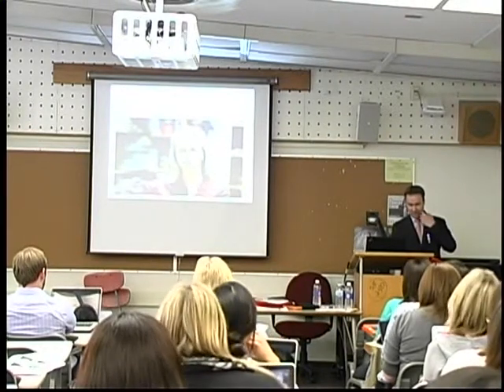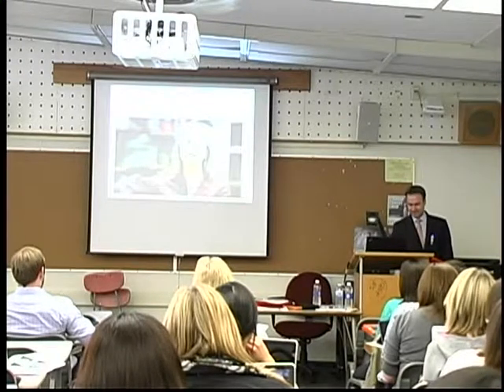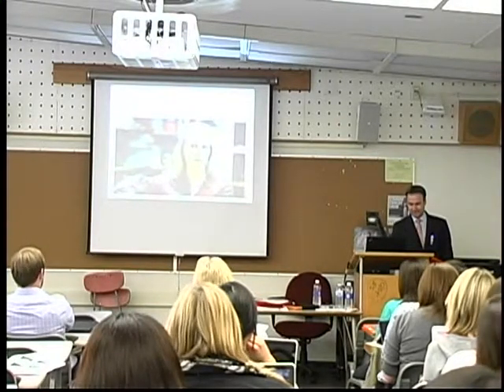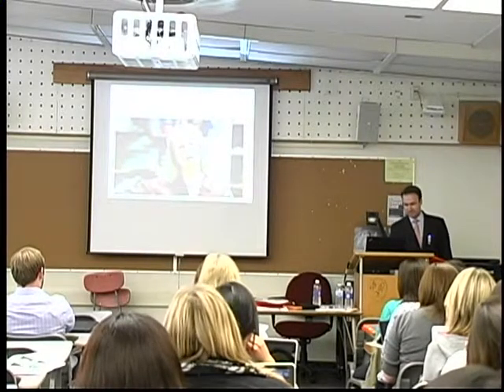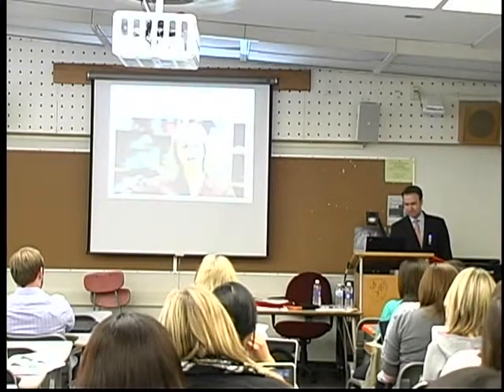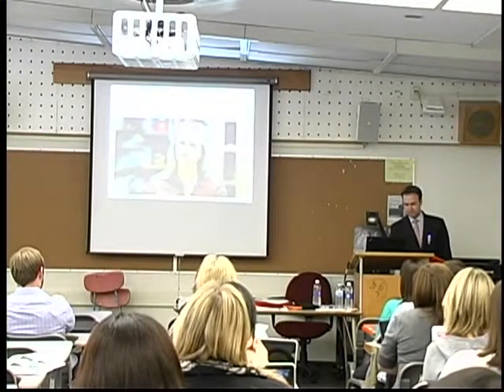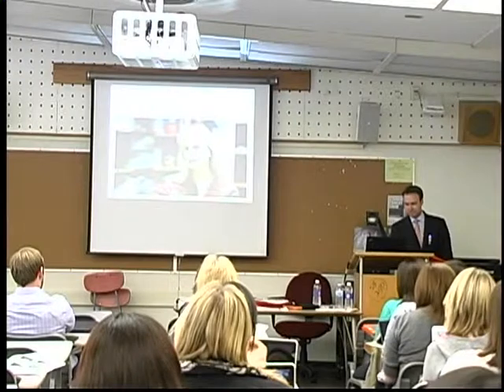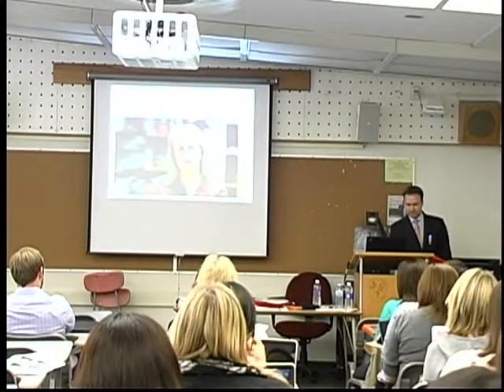So yes, her sister is really great at using the Speak All as well, which I think makes it more attractive for Mallory, because not only does she do it, but her sister likes it too. And you can see her thinking, okay, this is something that lots of people like to work with, not just me. And so it makes it interesting for her, and also it helps to involve her sister in the therapy.